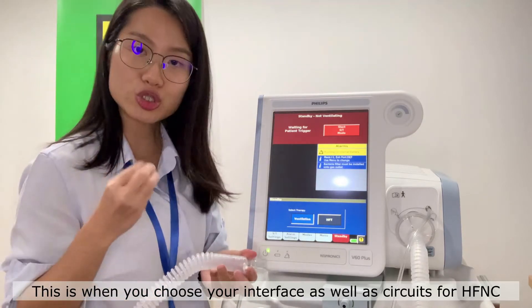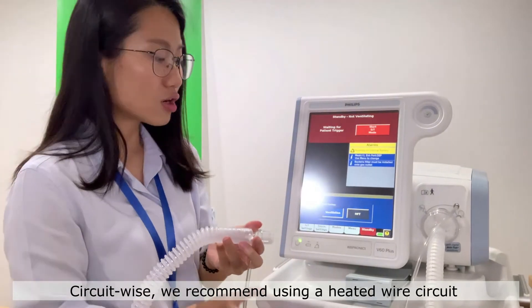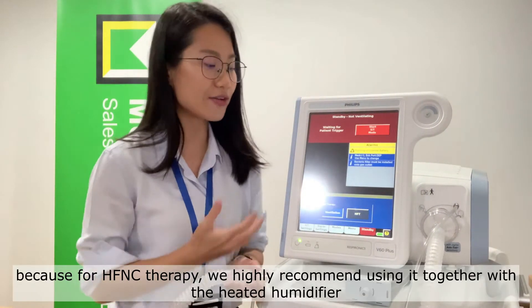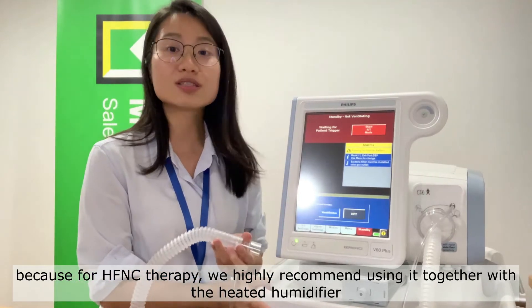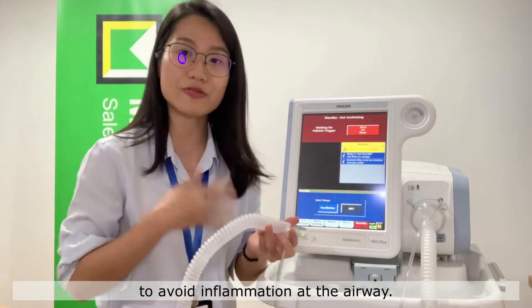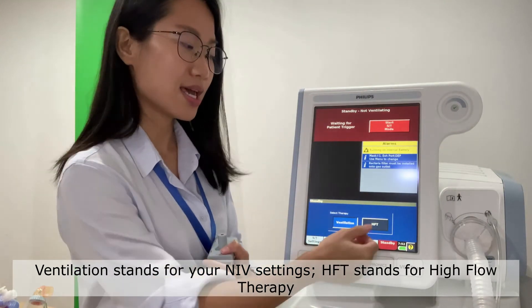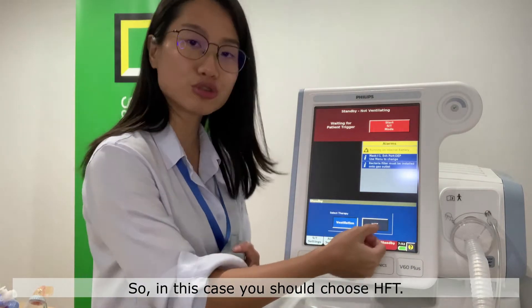This is where you choose your interface as well as your circuits. For circuits, we recommend using a heated wire circuit because for high flow nasal cannula therapy, we highly recommend using it together with the heated humidifier to avoid inflammation at the airway. Ventilation stands for your NIV settings; HFT stands for high flow therapy. In this case, you should choose HFT.